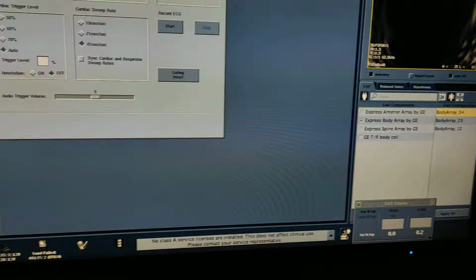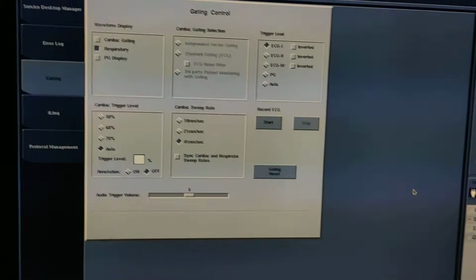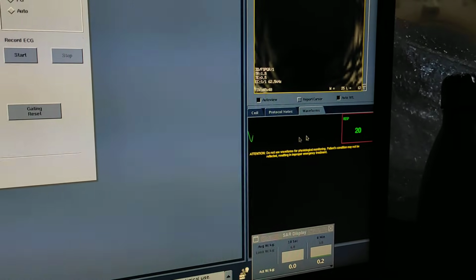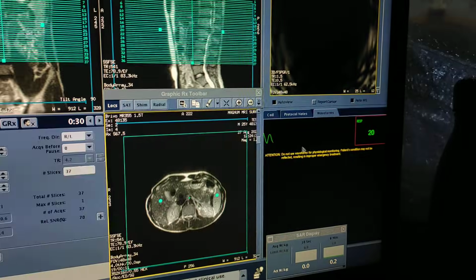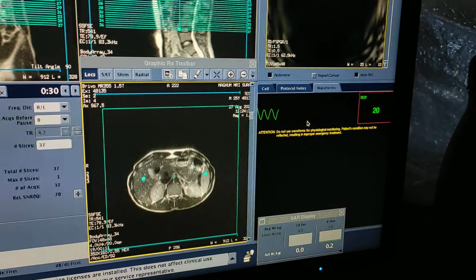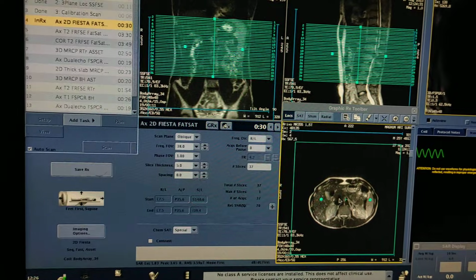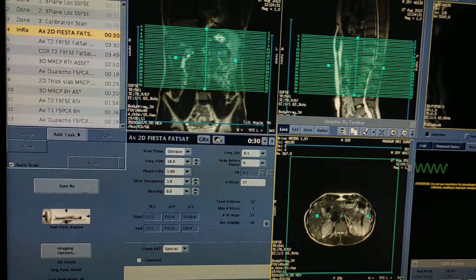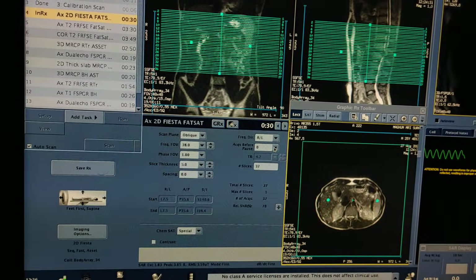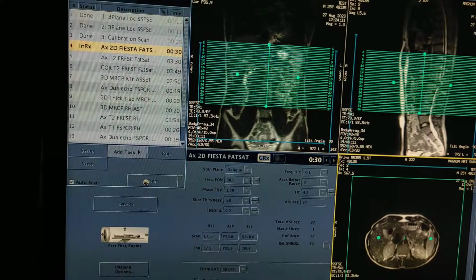From here you have to start the respiratory gating. Now you have to start from this waveform. You can see the respiratory gating. The patient is at 20, respiration is 20. So this is a good sign for better images. First of all I will take the 2D FIESTA. I am not asking the patient to breath hold, though you can do it with a breath hold also. Save Rx, scan.